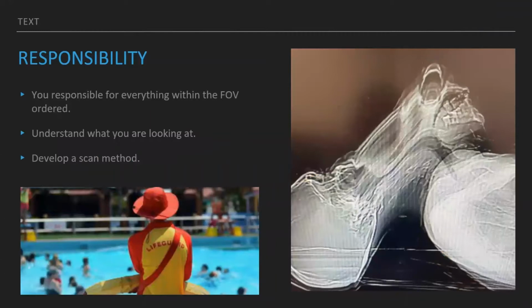So the responsibility, that's the biggest thing. You're responsible for everything within that field of view that you ordered. So understand what you're looking at, and develop a scan method.